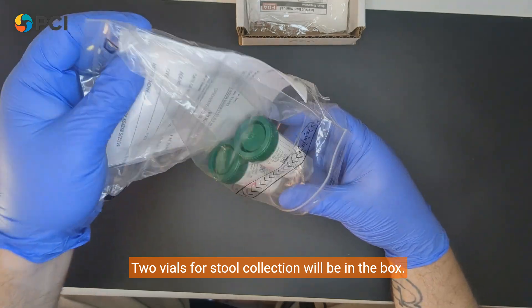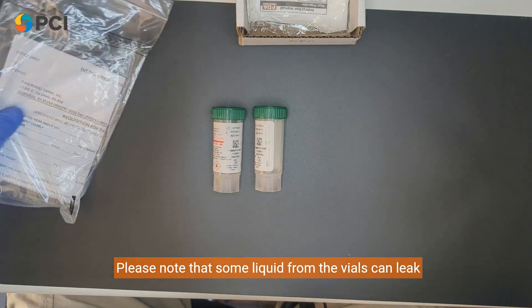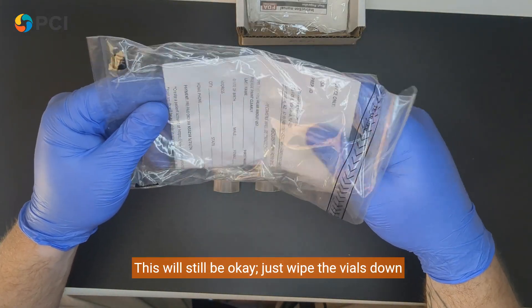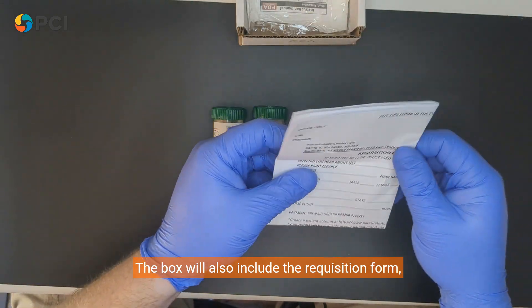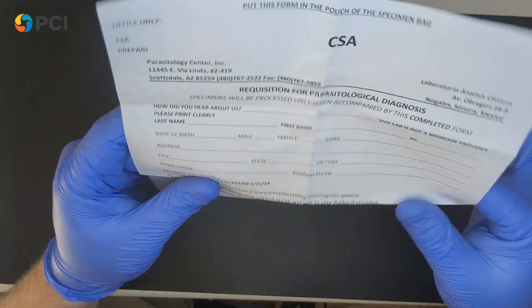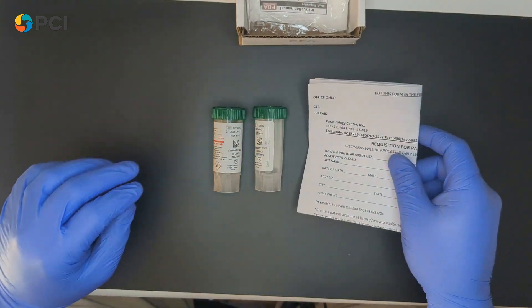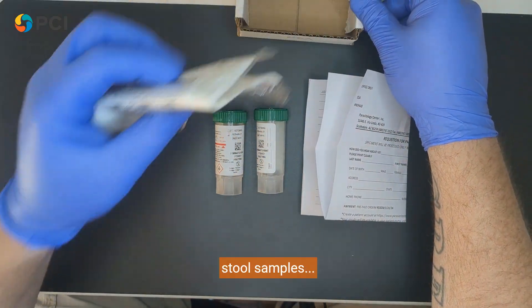Two vials for stool collection will be in the box. Please note that some liquid from the vials can leak out during transit — this will still be okay, just wipe the vials down with a paper towel. The box will also include the requisition form, which needs to be filled out. You will also get two collection sampling sheets for stool samples.